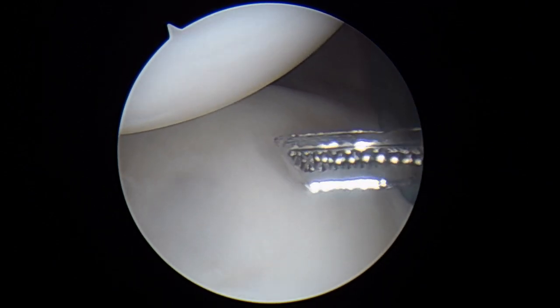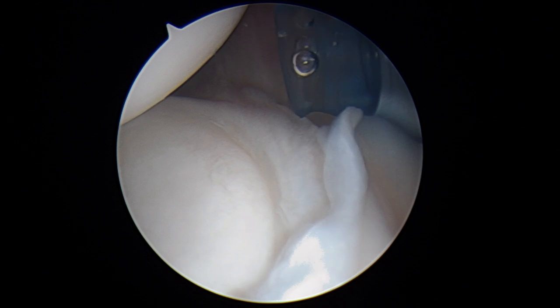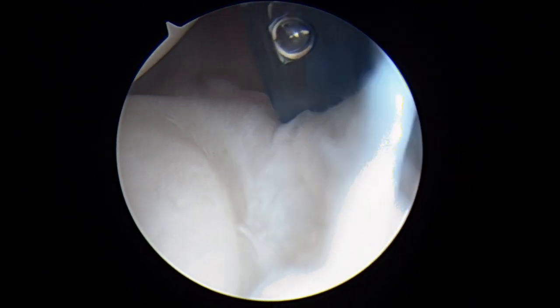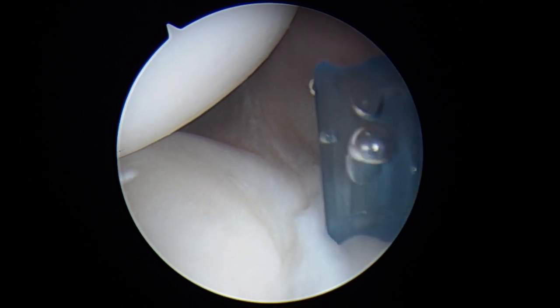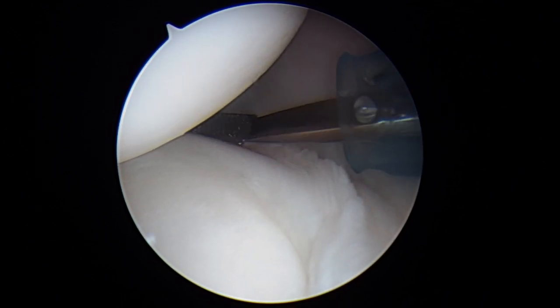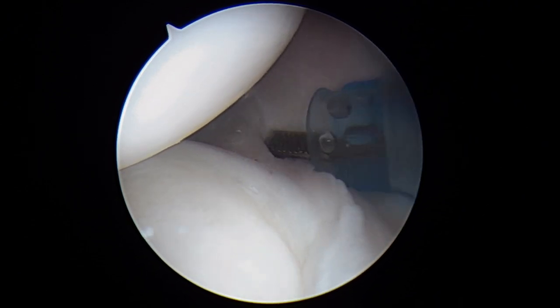This instrument is called a rasp. You can see it's got these sharp points on it, and we're going to use this to just gently abrade this posterior band of the inferior glenohumeral ligament right in this region here.